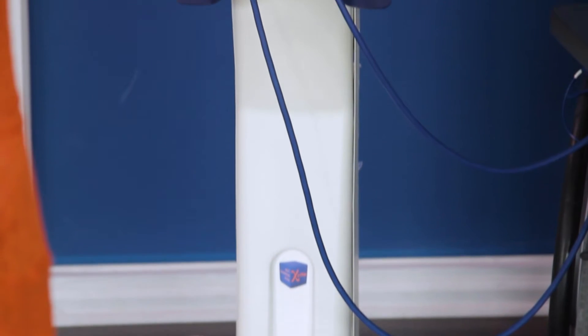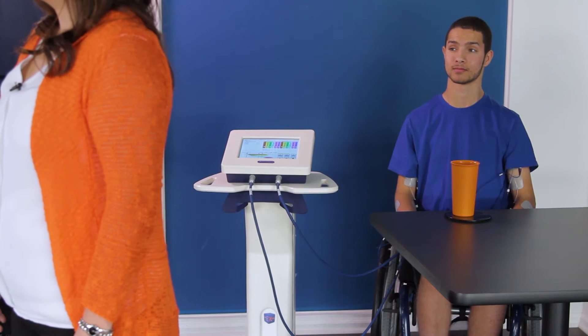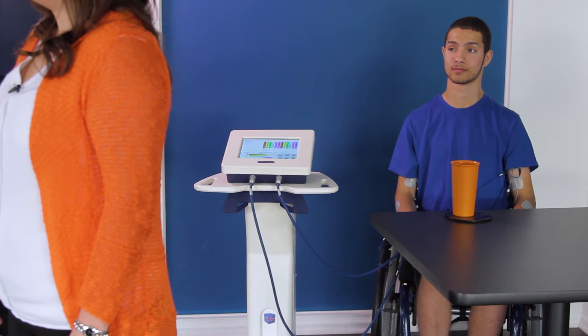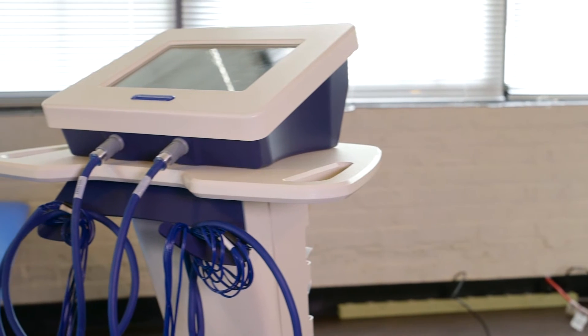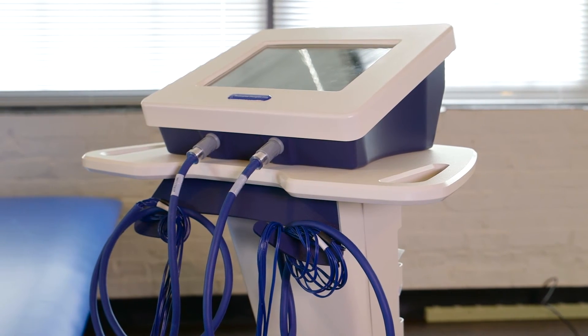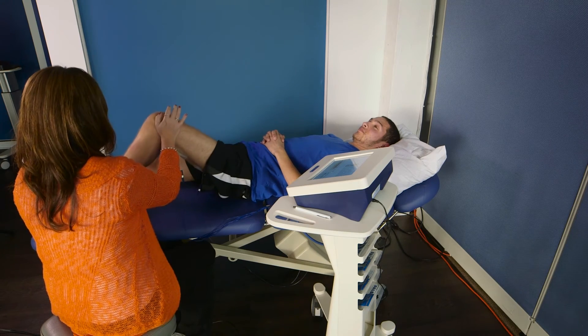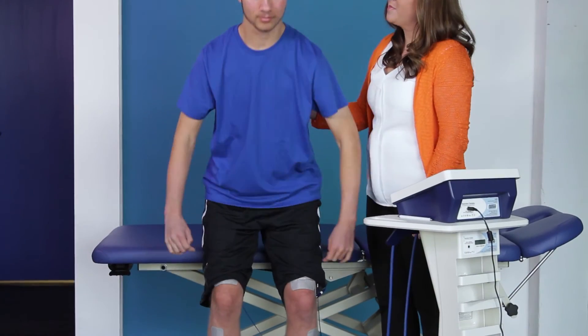This compact, standalone and portable Excite FES station can provide up to 12 channels of FES. The Excite Stimulation Controller attaches magnetically to the top of this wheeled cart. This station can easily be moved within a clinic or home, adding tremendous functionality and flexibility while ensuring the safety of the device.